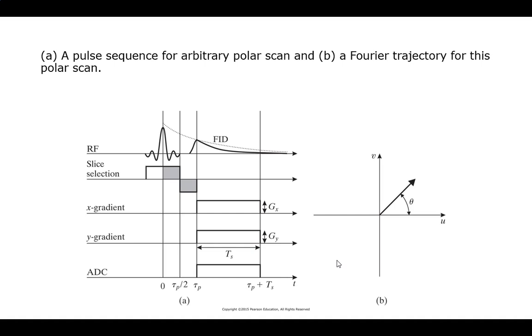So during the sample period, if you give me a longer time, I'm getting a better density on them. Right, okay, that makes sense. That's kind of the relationship I would expect. And then when you actually take your ADC samples in the sample time, that gives you the length of that. Is that correct? Yeah, because in essence, you're getting a whole bunch of measures here, and you're going to have to do a Fourier transform to resolve out the frequencies. Okay, I was just making sure that it behaved the way I thought. It really is exactly what you think it's going to be. That's how it's designed.